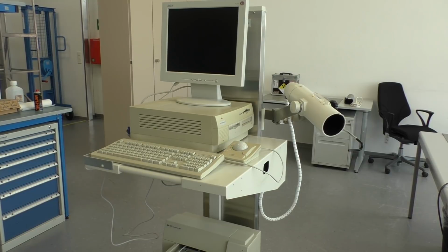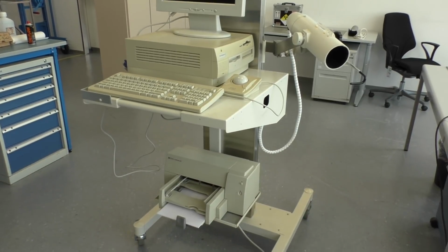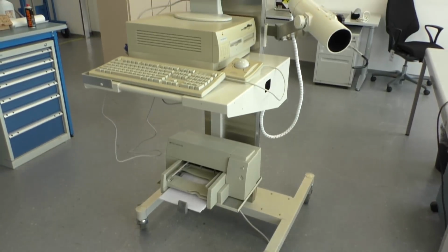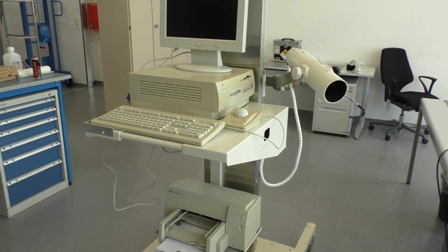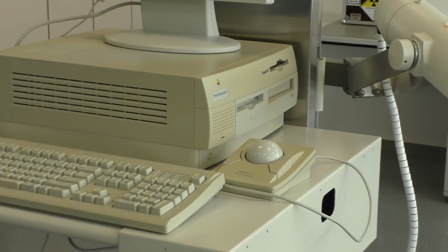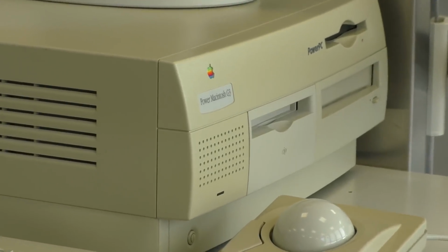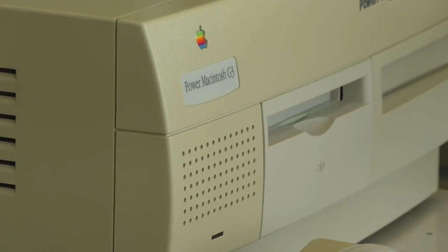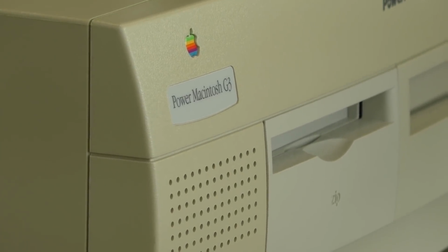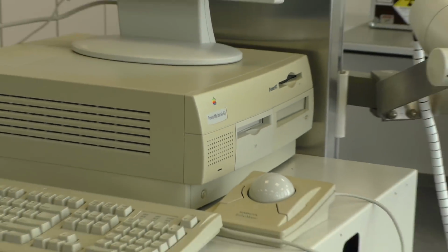This time we have this device here, which I first didn't know what it is, but when I saw the old Powermac G3 here, I thought that could be interesting just because of the computer itself, and maybe it's something interesting too. Well, let's have a look.